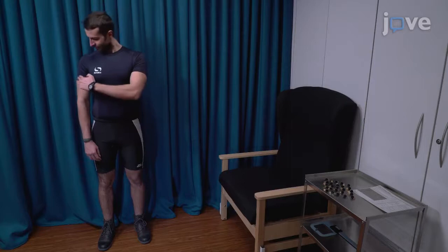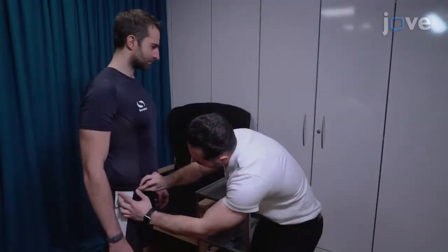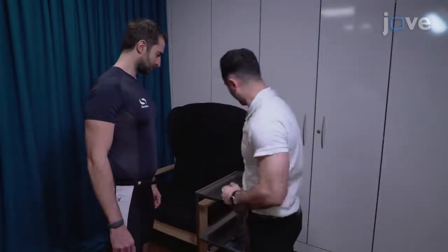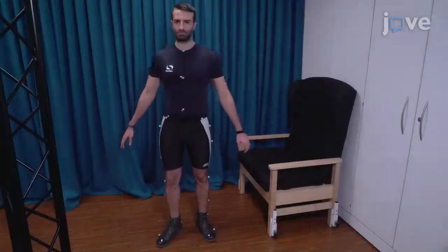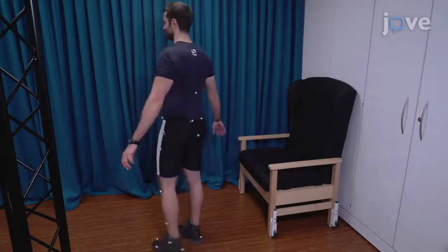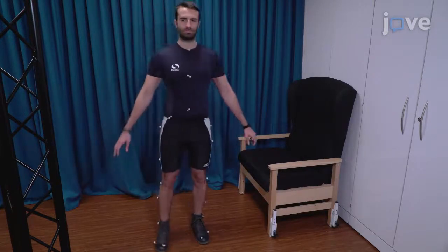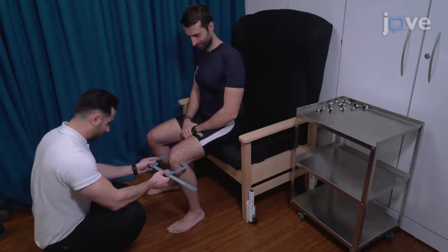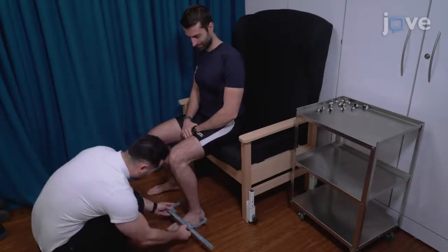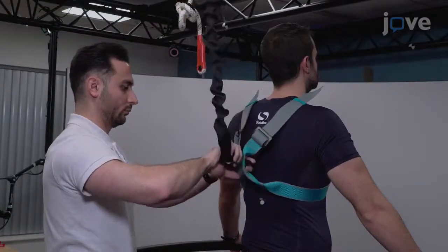Before beginning the analysis, confirm that the participant is wearing tight, non-reflective clothing such as cycling shorts or leggings, and use double-sided adhesive tape to attach 25 passive reflective markers onto the participant according to the lower body configuration of the human body model as illustrated. Use a joint ruler to take measurements of the required knee and ankle widths for the model, and secure the participant to a safety harness that is fastened to an overhead frame.